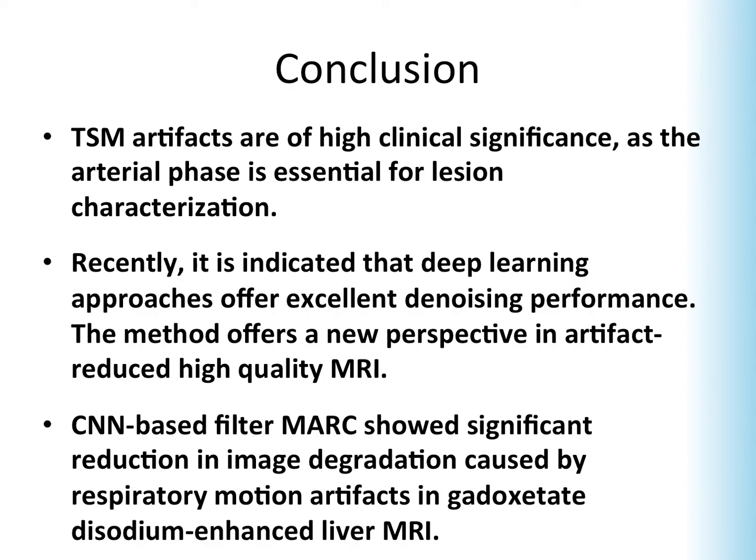Especially here, CNN-based filter and the one which we developed, the MARC, showed a significant reduction in image degradation caused by those respiratory artifacts in gadoxetate disodium enhanced liver MRI. So this method really can be of high clinical value, as it leads to an improvement in image quality and diagnostic accuracy, especially in those subjects with failing breath hold in the scan.